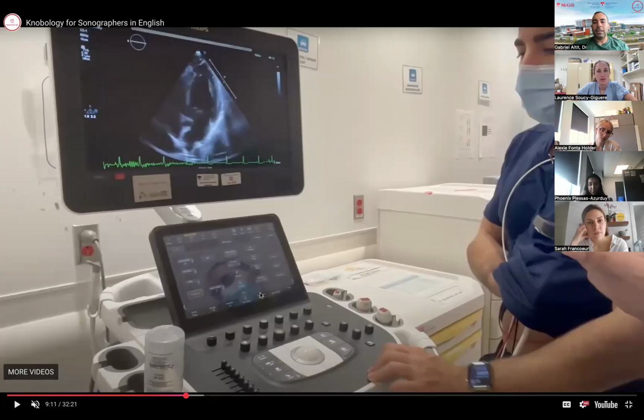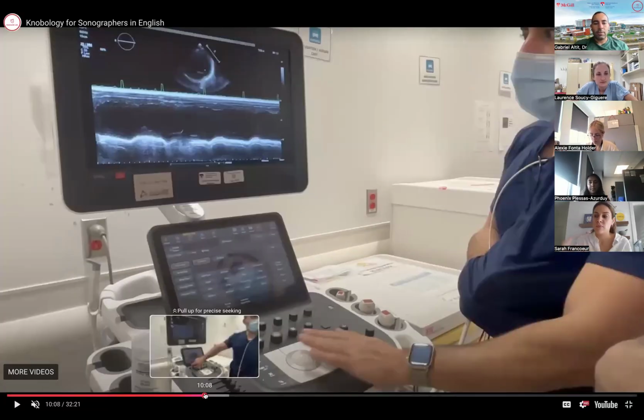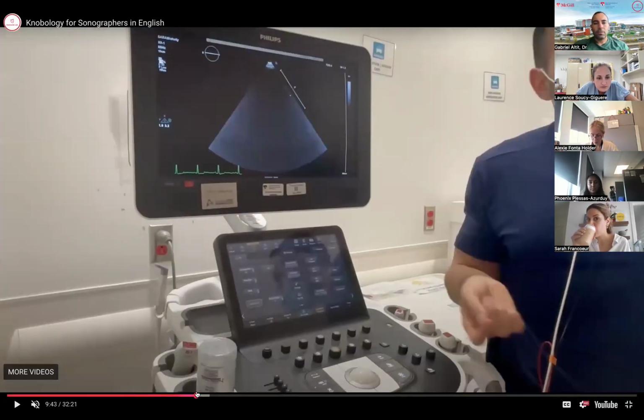Okay, so at the button here, if I click this button, it will bring my selection to this. If I click back this button, it will bring me my selection here. And if I just click this button, especially if you have multiple choices, it will go from this side to this side to this side to this side, versus this one, it's going to go the other side. I don't know if you see what I mean, but let me show you an example here.